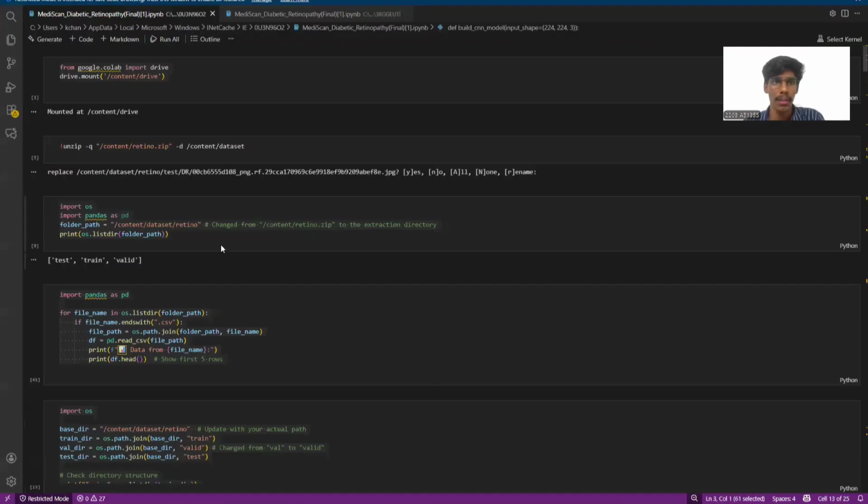So now this is my code. In this first cell, it basically creates a bridge so you can access, read, and save files stored in your personal drive directly within the coding environment. The second cell loads the OS, imports pandas, and defines exactly where the folder is located. The command os.listdir reads the names of every file inside that folder and prints them out so you can verify your data is there.